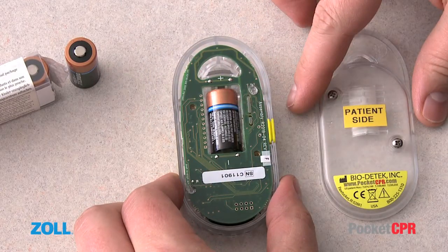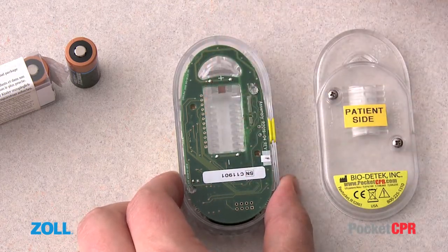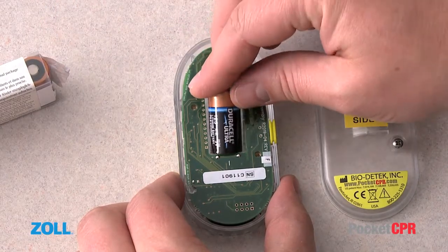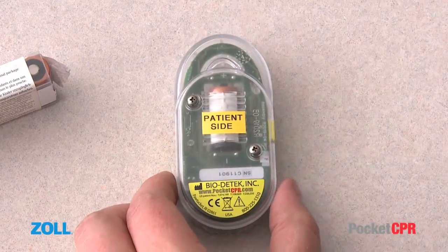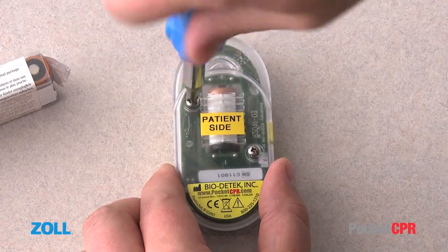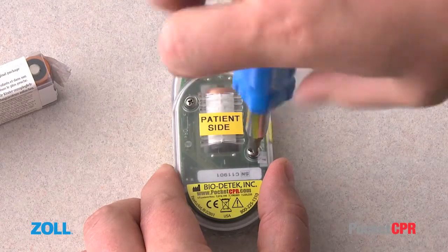On the circuit board, you will see a white plus sign. The battery can be easily removed by lifting up this end of the battery. Be careful not to touch the circuit board. Replace the battery with a Duracell Ultra 123 lithium battery by inserting the negative end first and then pressing down gently on the positive end until the battery is firmly in place. Replace the bottom cover and screws. Tighten the screws gently.